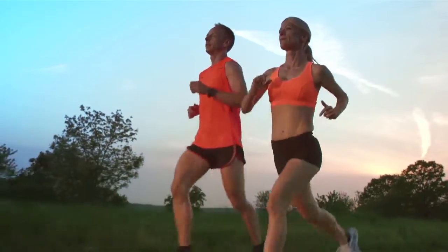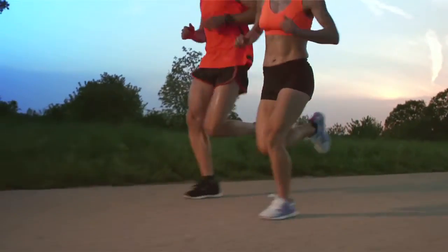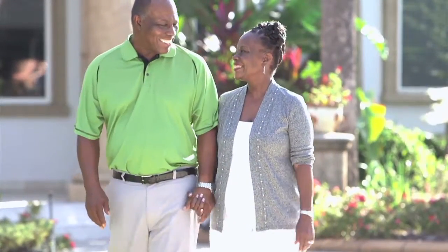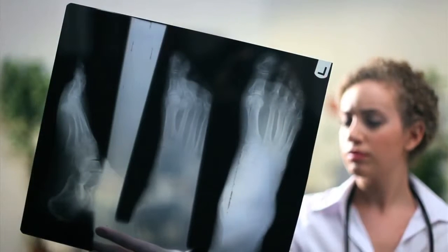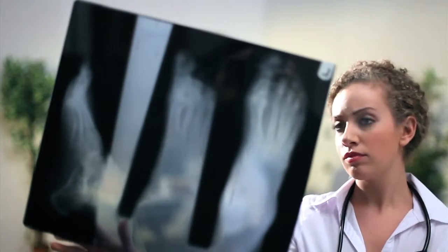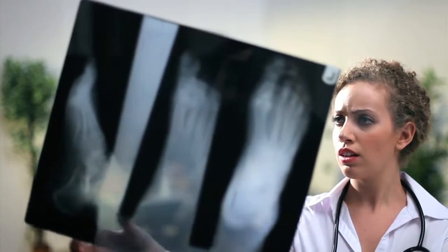Related pain is often caused by the overuse of the plantar fascia, increased activity, weight, or age. Also look for trigger points in the muscles of the sole of the foot in patients with plantar heel spur, postural deficiencies, or malalignment of the foot.